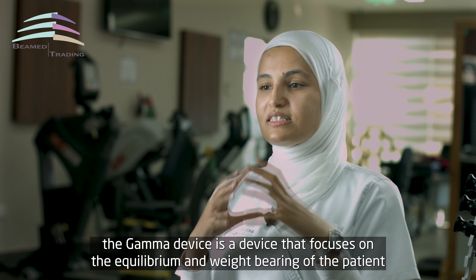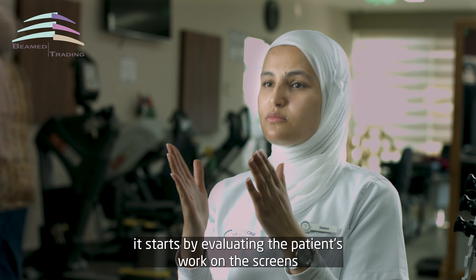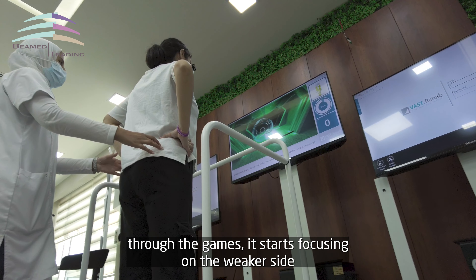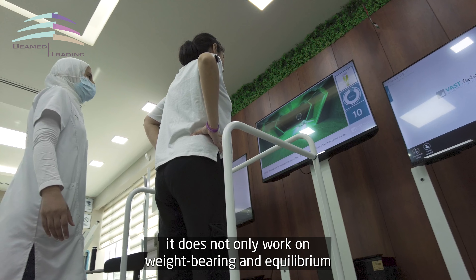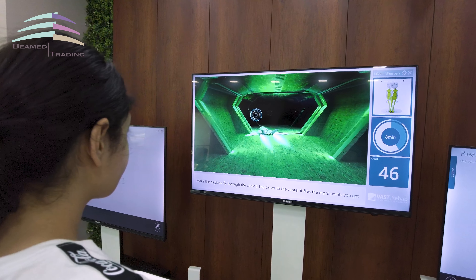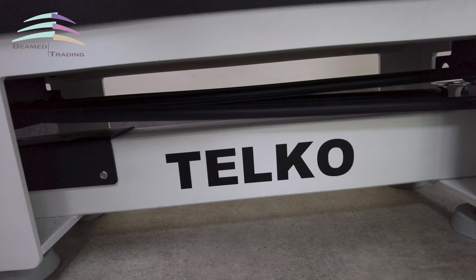جهاز القامة هو جهاز بيركز على توازن وتحميل الوزن عند المريض. بيبدأ بعمل تقييم للمريض، وعلى الشاشات بيبين للمريض الجهة اللي بيحمل فيها وزن أكثر من الثانية. ومن خلال الألعاب بيبدأ يركز على الجهة الأضعف، ومش بس بيشتغل على تحميل الوزن والتوازن، كمان بيدمج لنا التركيز والذاكرة والتناسق الحركي، وهذا الشي بيعطينا نتائج أفضل على مشية المريض.